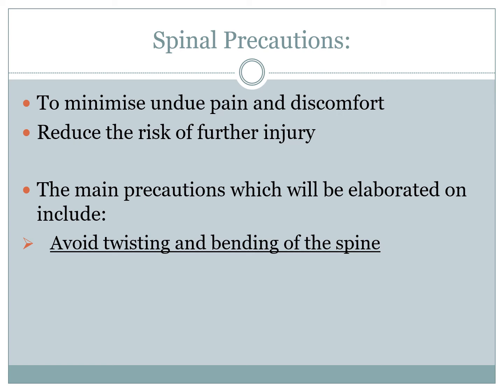By adhering to the spinal precautions, the person will also be keeping the spine in the best position to allow for healing. The main precautions which will be elaborated on include avoiding bending and twisting.